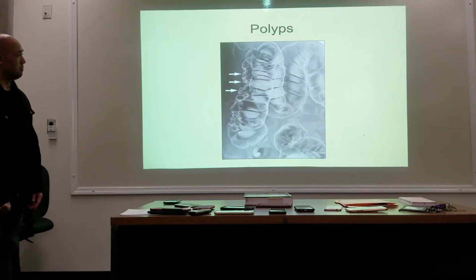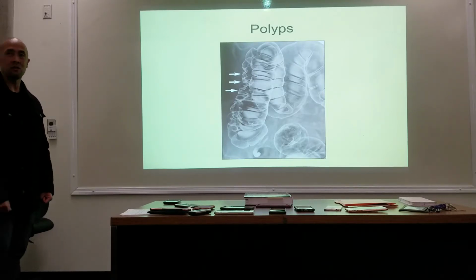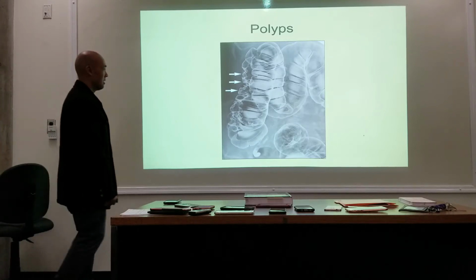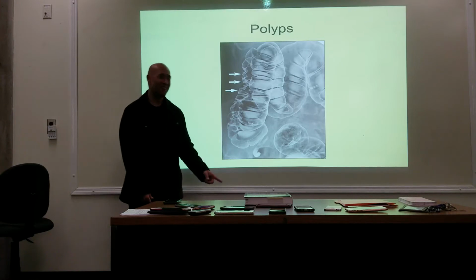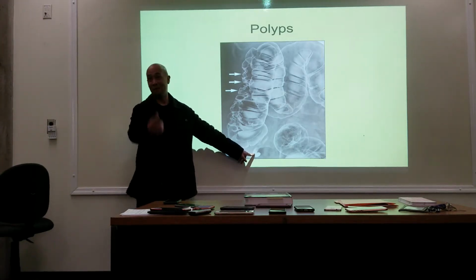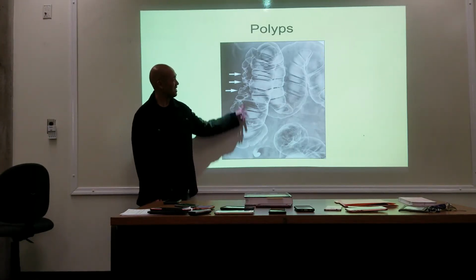Okay, what part of the colon is it pointing to? Ascending. How did you come up with that conclusion? The loop, how it drops. You can see the appendix. Oh yeah, okay, the appendix. In the appendix, yes. Okay, so this is ascending.